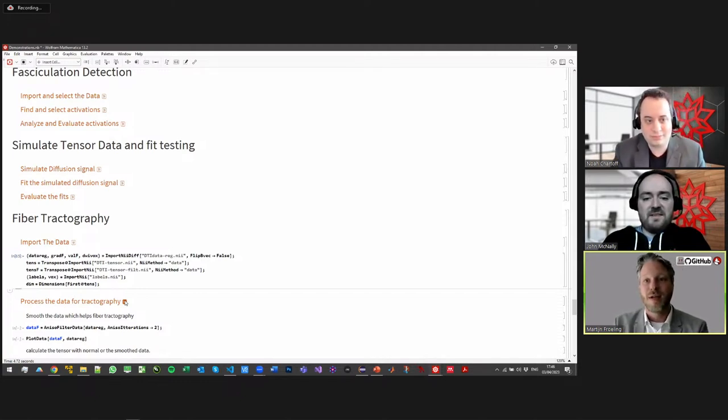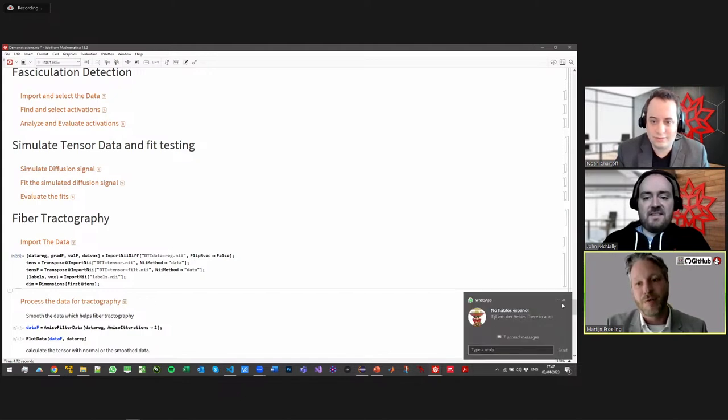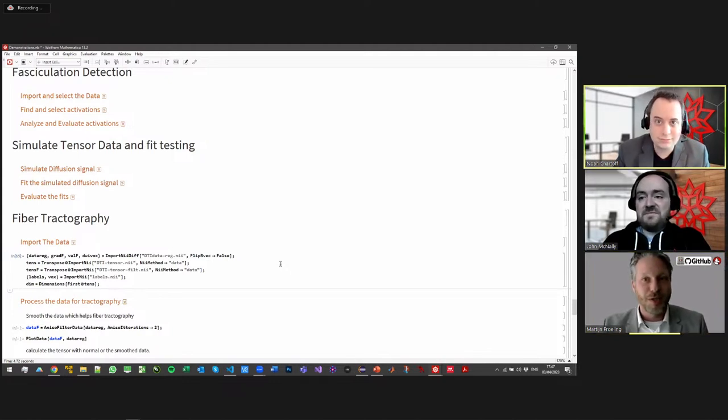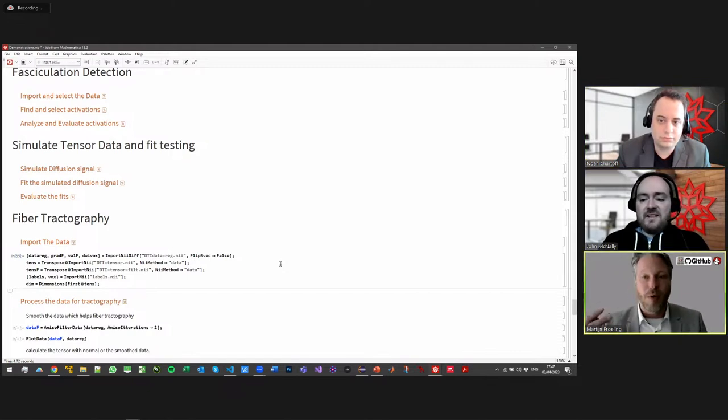So we can see that a neuromuscular patient is different from a healthy one. We don't need these techniques for that. But we do need techniques to evaluate medication, for example. If we start giving patients medication, is it working? It's expensive. You don't want to wait 5 years to see if things get worse or not. You want to see very small changes in the early stage. And therefore, we're developing more of these techniques.